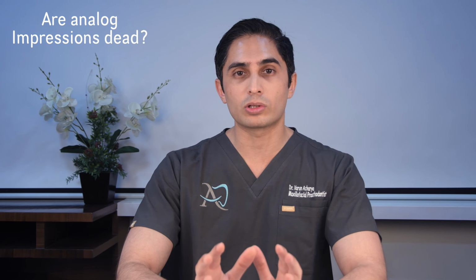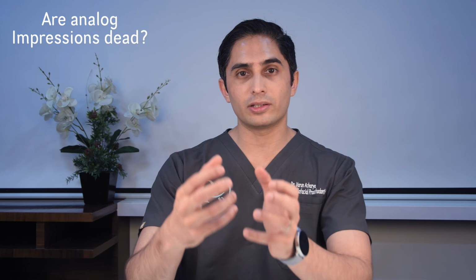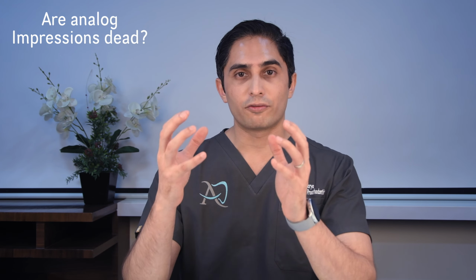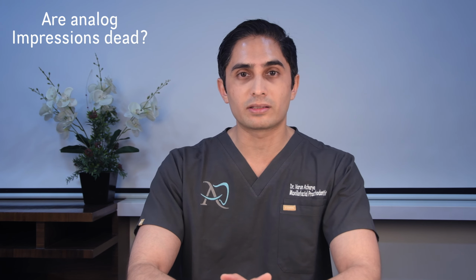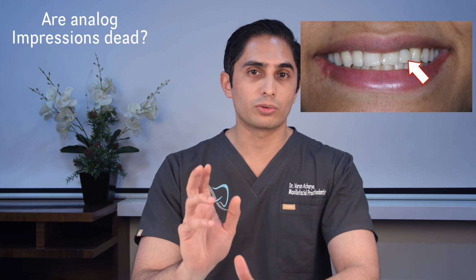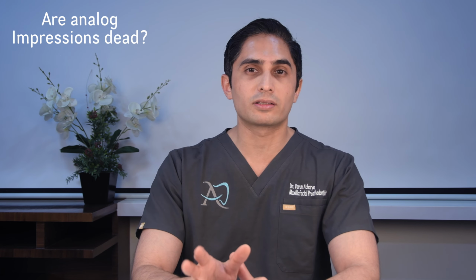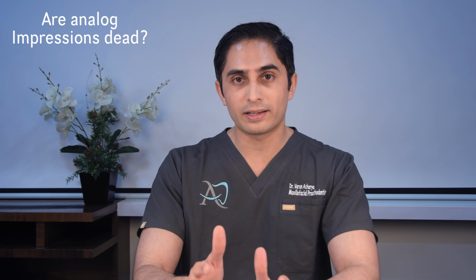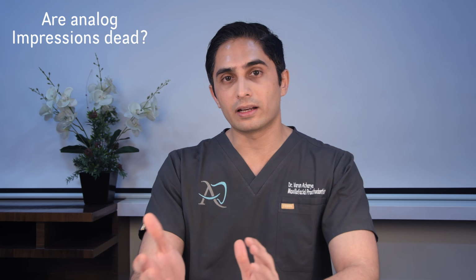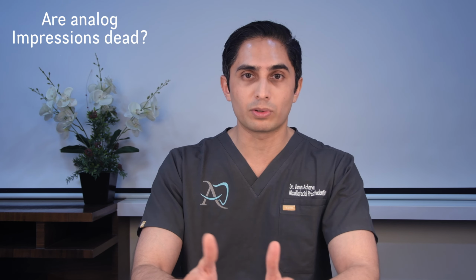And remember, an intraoral scanner takes things into the digital world, but at the end of the day, you still need something physical or analog to deliver to the patient, and it could be something as simple as a temporary. So we've found that, for example, temporaries are a lot faster to do the analog way rather than taking an intraoral scan and then 3D printing. That's all going to be time consuming compared to just making a simple temporary.